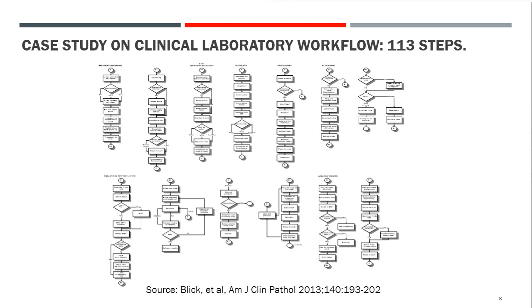They didn't realize they had quite that much, and this is somewhat, there are a few missing here, but this is what they came up with. They approached it from the perspective, a very good perspective, that every step, every process, every box is an opportunity for error. And the point of trying to reduce the number of boxes, improve the process workflow, is to reduce the opportunities for error.